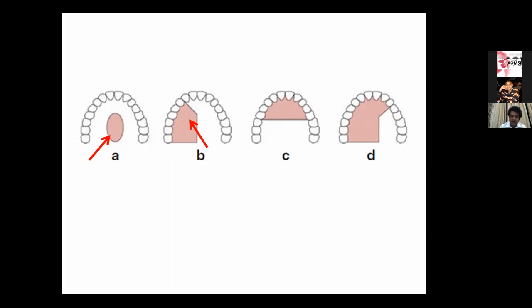So most of the time you end up placing your zygomatic implant somewhere in the second premolar or molar region only. It is very difficult to place your implant in the canine region or the first premolar region because the canine or premolar will interfere with the handpiece or the long drills.